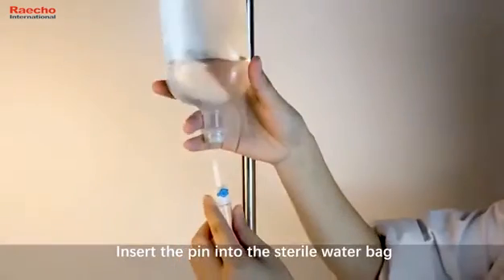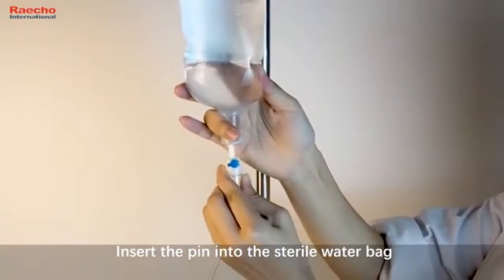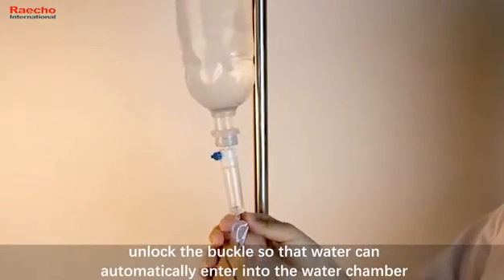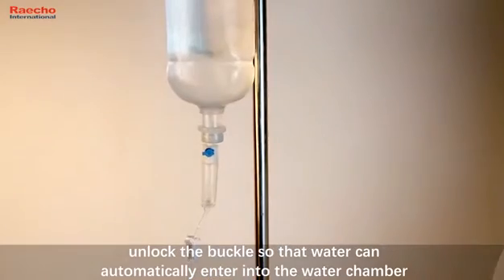Insert the pin into the sterile water bag. Unlock the buckle so that water can automatically enter into the water chamber.